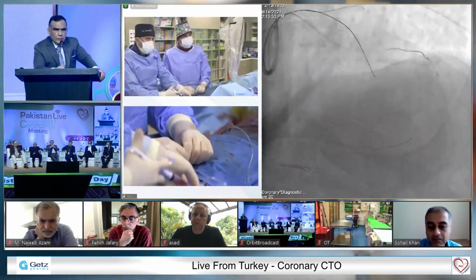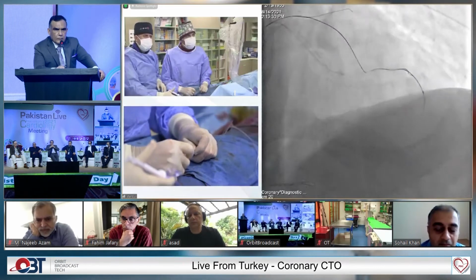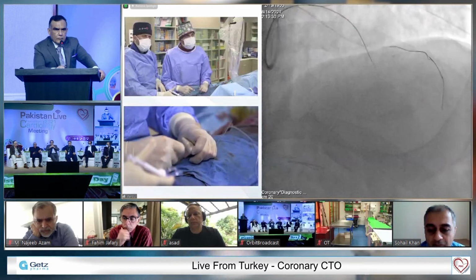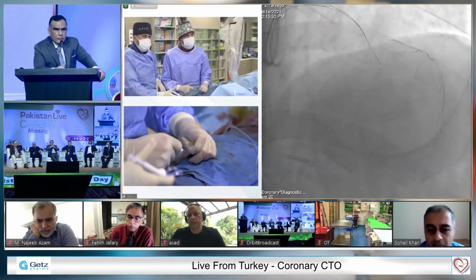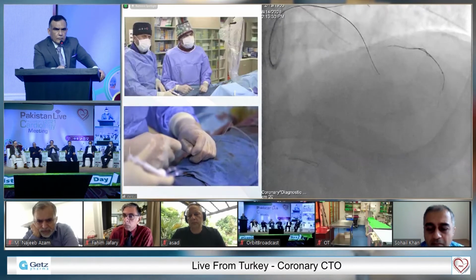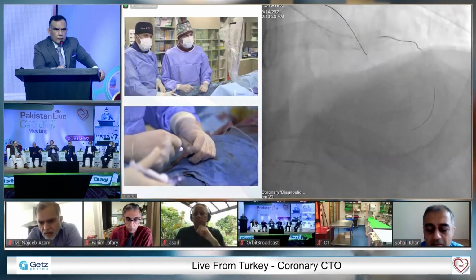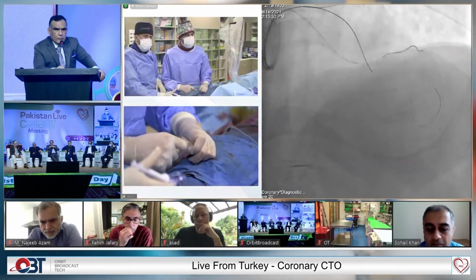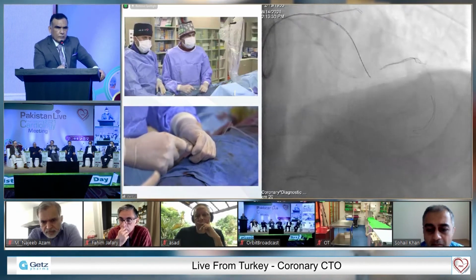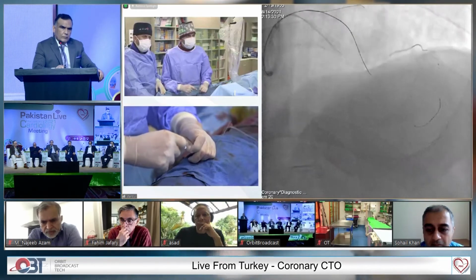Where is it going? As in terms of macro, let's see. For Sion, since it's not that tortuous, it's a bit not tortuous, right? So here also, I'm happy with the Sion. If it's tortuous, you are right. We can use Suoh, especially for the atrial branch.